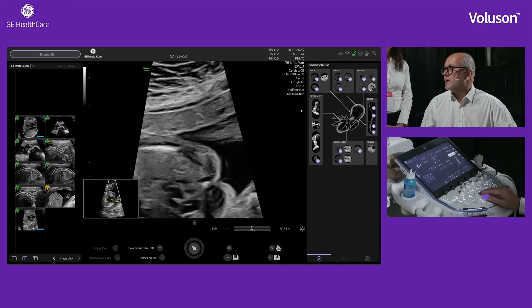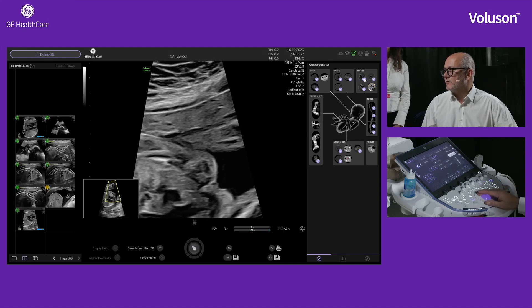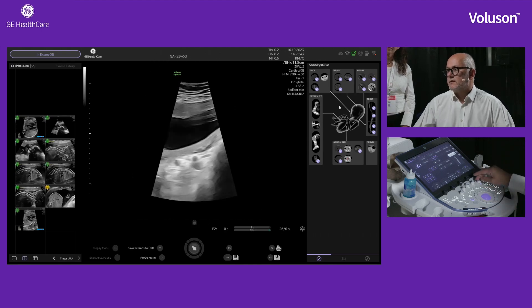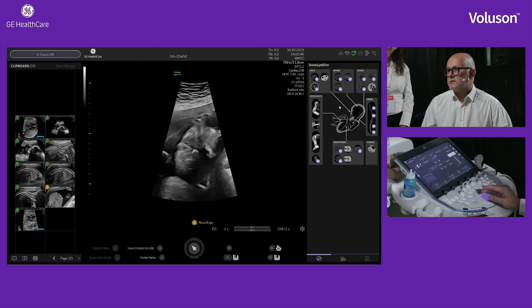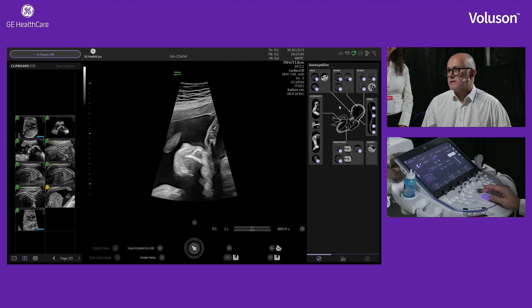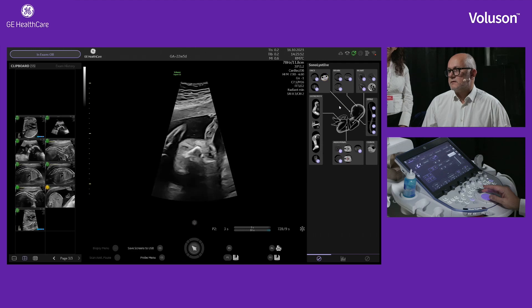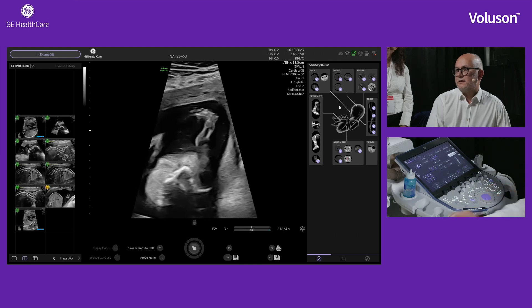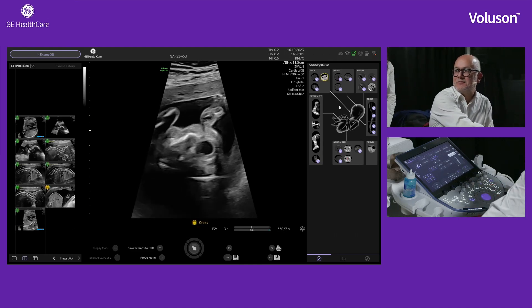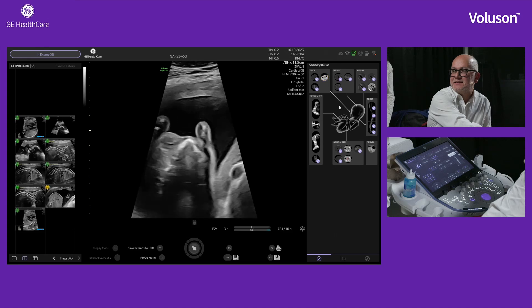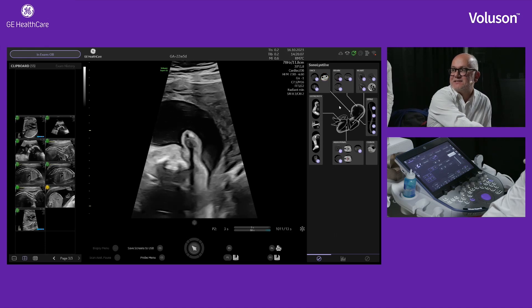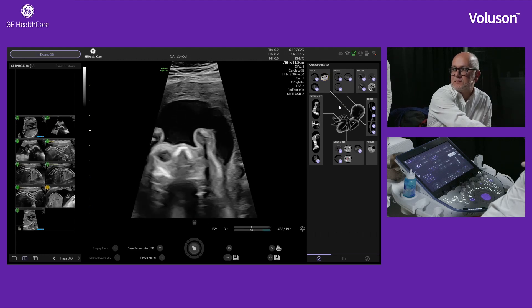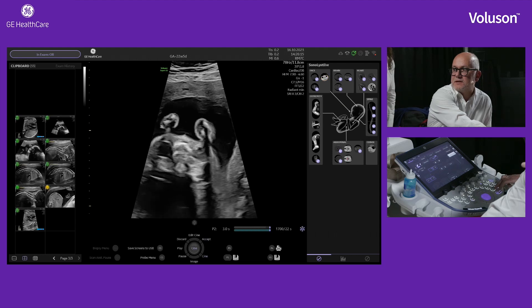It has captured one of the images — we've set it to require three. In the orbits, it's reminding me that it needs me to look at the orbits of the baby. Sometimes, as happened just then, it may not be happy with the image for a variety of reasons. Of course, you can manually capture images as well — just freeze and manually capture. The system is intended as an assistive tool, not to take over your daily function, but to help while you are doing the scan.